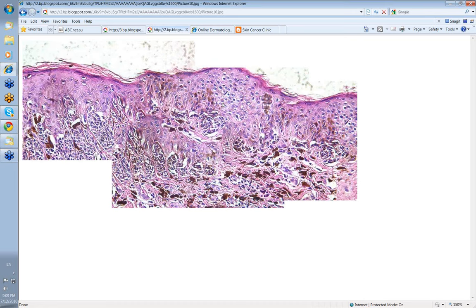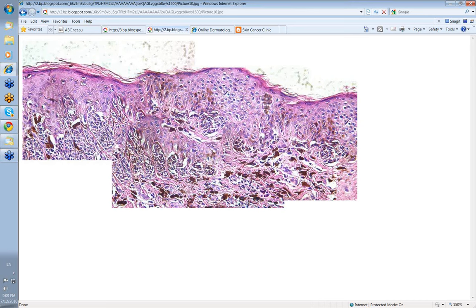Yeah, well when I looked at that I could see some angular abnormal nests of melanocytes at the dermoepidermal junction. You can see those down there as clusters of angulated nuclei of different sizes. There are also some apparent melanocytes up in the epidermis rising up towards the stratum corneum, and I interpreted that as pagetoid spread, but those particular cells to me looked fairly monomorphous.